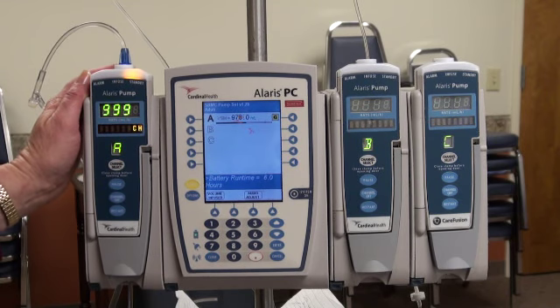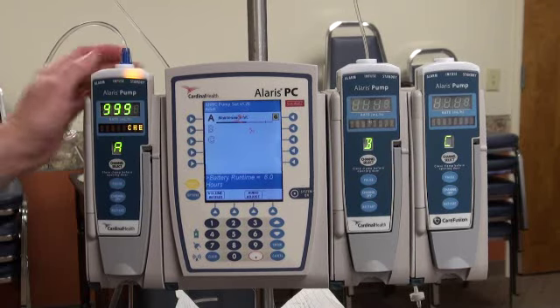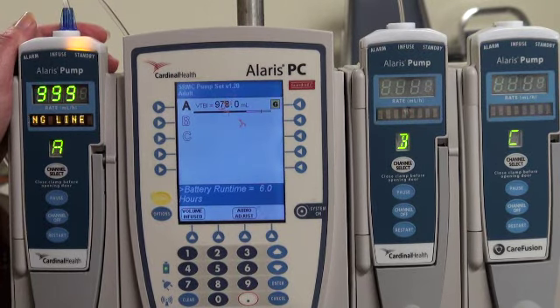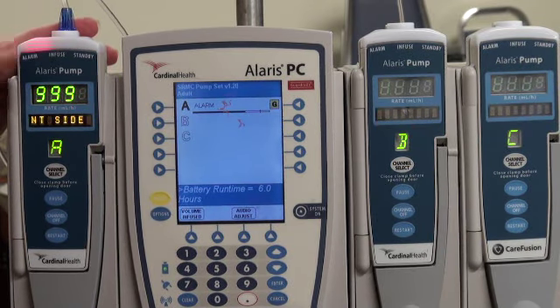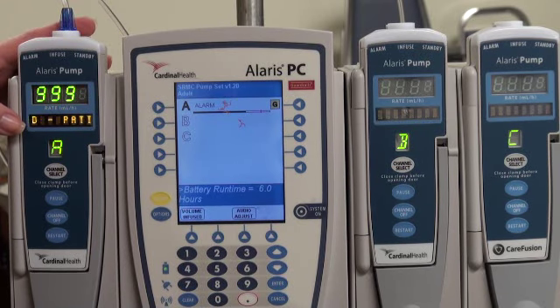It's going through in its memory box. It detects something isn't right. It's going to go through this and check it. Okay, here's your alarm. It's the red. And if you read the screen, it says occluded patient side.